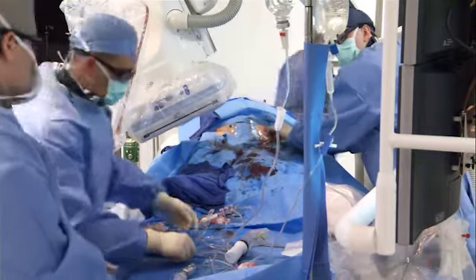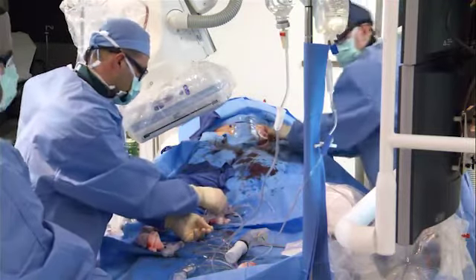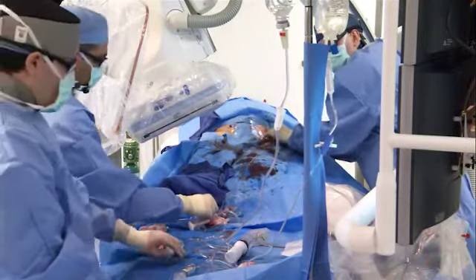The other option would be CSI, but we are subintimal, and when you are so subintimal, I'm not sure how much it helps you. It may help you. I'd be interested as to what other people think, but that's my feeling. I agree with both of your comments. This is really long. It's only one vessel runoff. If you embolize, it's toast. It's a very difficult thing to get out of the problems that occur here.